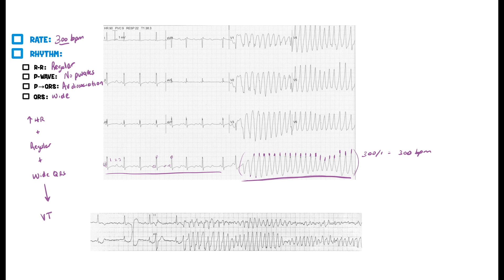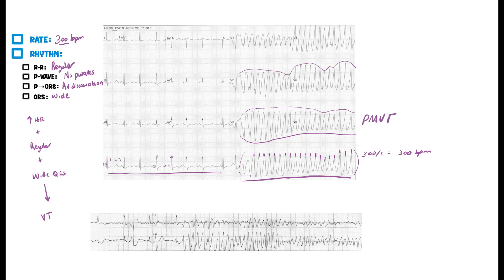Remember the last EKG we said was monomorphic — they all looked the same. But this is different. Some of these QRS complexes are a little shorter than others. In V2 or V5, some are peaked and then some dip down and come back up. Going further, some go up and then dip down. These QRS complexes are not all exactly the same — they're polymorphic. So this is a type of polymorphic V-tach.